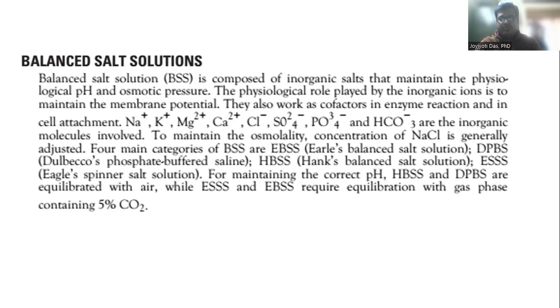So why does a balanced salt solution serve the purpose of keeping your cells alive for some time? Because it will maintain the osmotic pressure of the cell, and it will also provide ions which are required as cofactors in various enzymatic reactions and cellular attachment, right?